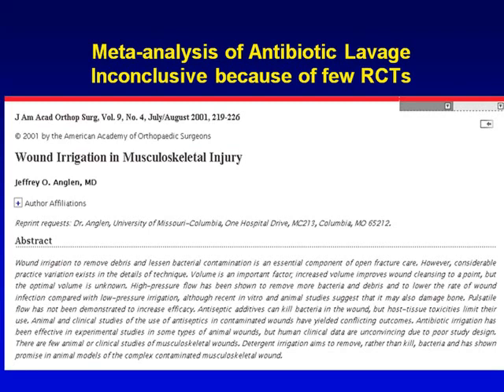Again, people have often said, well, why don't we wash out the pocket during the procedure with something like antibiotics. It's still currently recommended, and in fact, the latest ACC/AHA guidelines say it may be used, whatever that means, but there is no evidence that it works. So it's not evidence based. And some hospitals are attempting to save money, because it's not evidence based to use them.